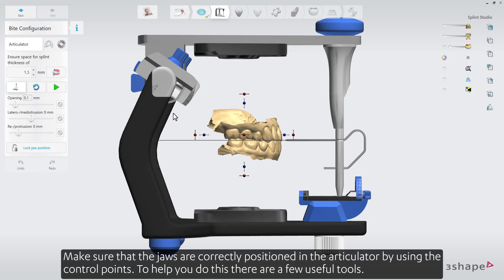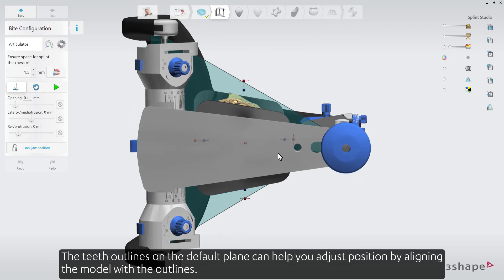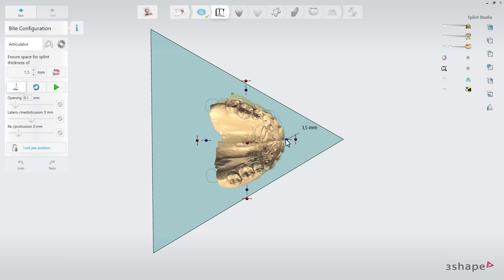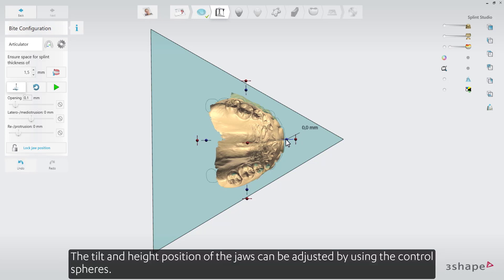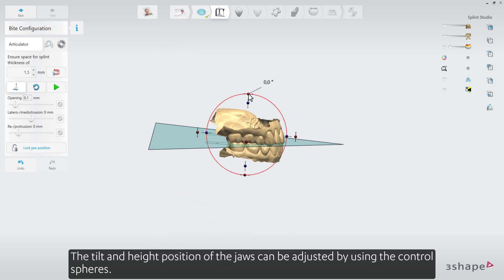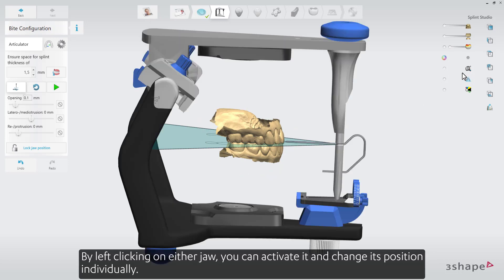Make sure that the jaws are correctly positioned in the articulator by using the control points. To help you do this, there are a few useful tools. The teeth outlines on the default plane can help you adjust position by aligning the model with the outlines. The tilt and height position of the jaws can be adjusted by using the control spheres. By left-clicking on either jaw, you can activate it and change its position individually.